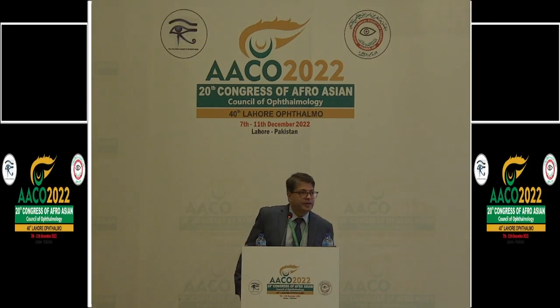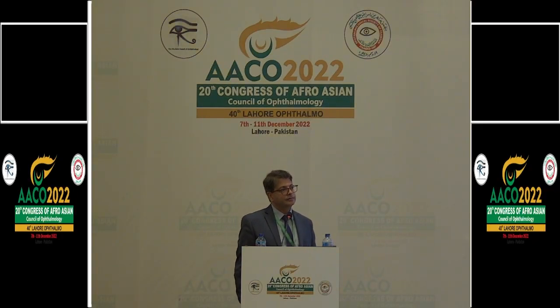Yeah, no, I totally agree with you, and you explained it very well. So not everybody has a SWEPS or OCT or Triton or something. So normal 2D, 3D OCTs originally. If you have a slightly dilated, undilated pupil with some media opacities, there are certain image differences which change the actual map of the appearance of the scan, and that suddenly looks like a significant change. But when you look back at the quality of the scan, actually the quality of scan is different rather than the actual deterioration. So people sometimes overtreat or undertreat because of the poor quality.